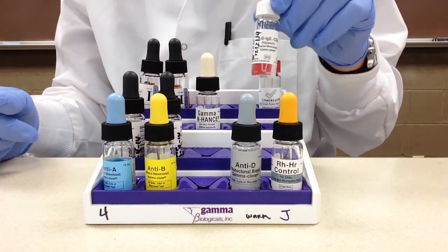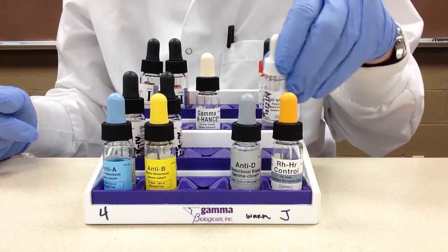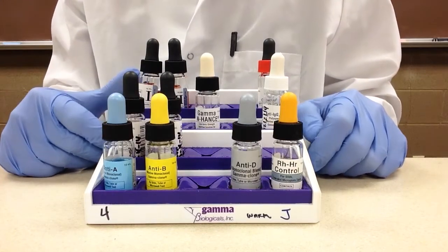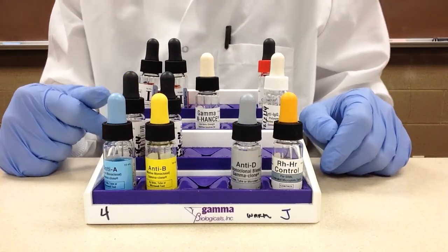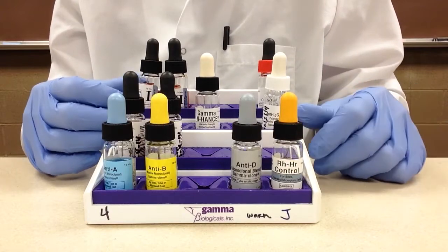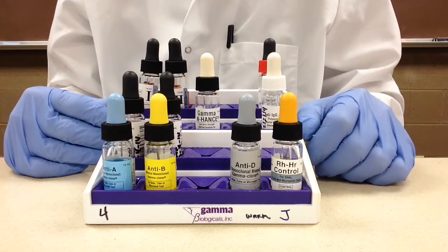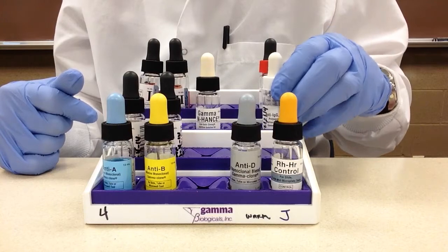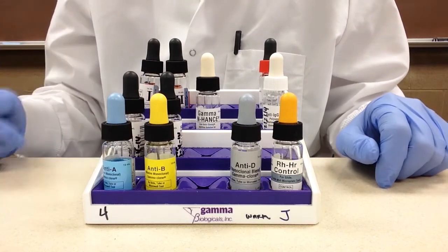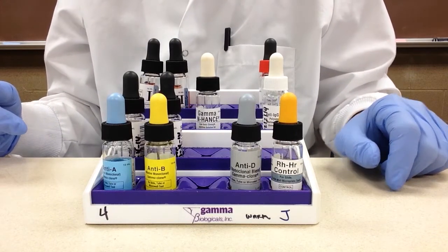Next to that we have our anti-human globulin. In this case we are using poly-specific anti-human globulin. Don't confuse poly-specific and monospecific with poly-clonal and monoclonal — poly-clonal and monoclonal refer to the production process of anti-sera, while poly-specific and monospecific refers to what type of antibody it is geared towards. Poly-specific means it contains anti-IgG and anti-complement, whereas monospecific would contain either anti-IgG or anti-complement.